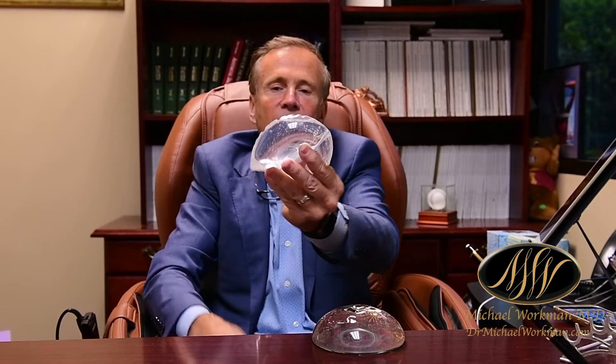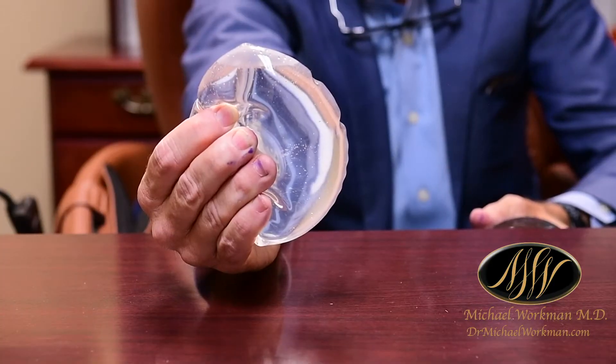And usually that's due to not having enough skin or fat in particular covering the implant. For instance, here's a typical saline implant and we can see that on the side of it, oftentimes there can be some subtle rippling.